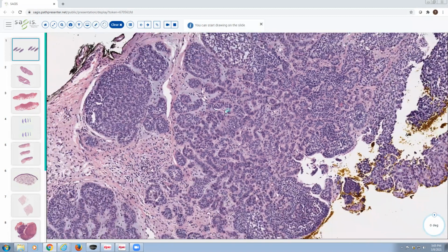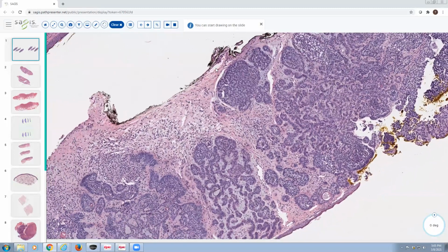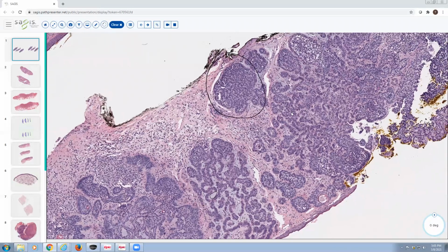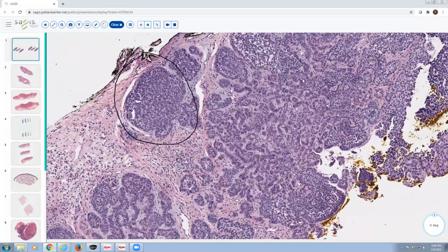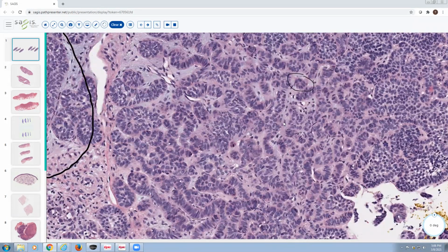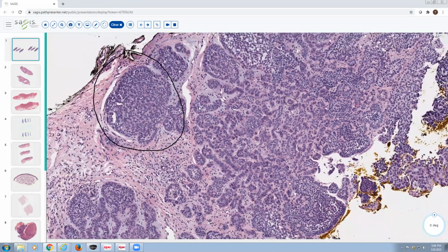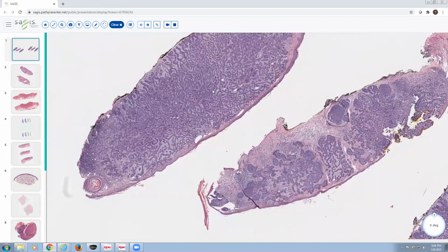Usually in micronodular basal cell carcinoma, you'll find some areas that look more recognizable as just your regular old nodular basal cell, like this guy here. But the predominant morphology is a smaller nodule. They still have that palisaded appearance to the nuclei, it's just that the nodules are smaller. And so this is a basal cell carcinoma, a micronodular type. And this is a little bit higher risk for recurrence and locally aggressive behavior, in the same way that an infiltrative basal cell or a sclerosing basal cell would be.